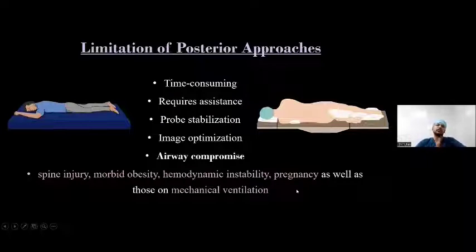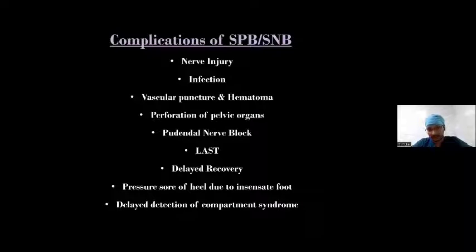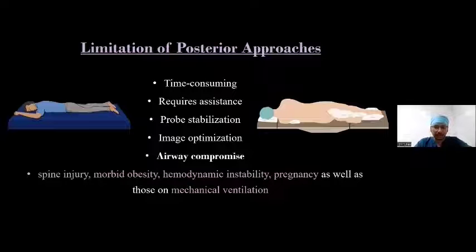So the limitations of the posterior approaches are that they are time consuming and require assistance, because you need to place the patient in prone position and then in supine position for surgery. The probe stabilization, especially in lateral position, that is Sims position, is sometimes found difficult, and image optimization also. And most important, in prone position, if these are deeper blocks, you need sedation. So there is always a risk of airway compromise in prone position.